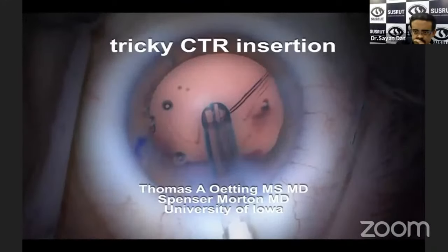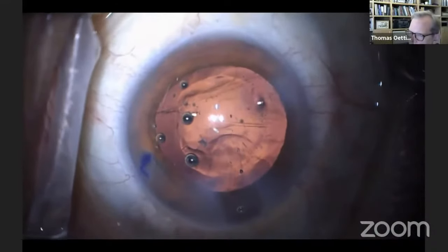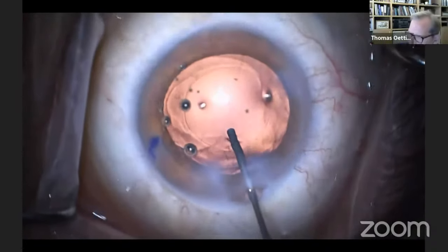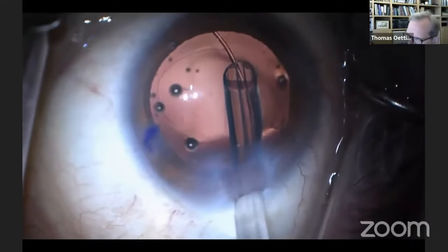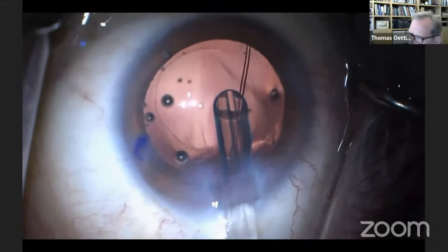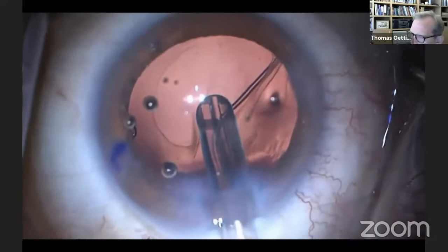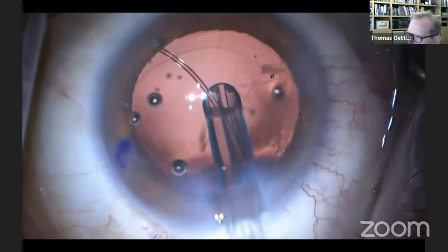The Sinskey placement of the capsular tension ring is also useful in cases like this. You can see there's really loose zonules here. We're able to wrestle the lens out of here, but we've got very loose zonules. So we're placing viscoelastic, and now we're going to place the capsular tension ring, and look what happens. It catches in a fold. The bag is so loose that the capsular tension ring catches in a fold and really begins to cause more harm than good here. We really are getting a lot of force on the capsular tension ring as it tries to go in this very loose bag.